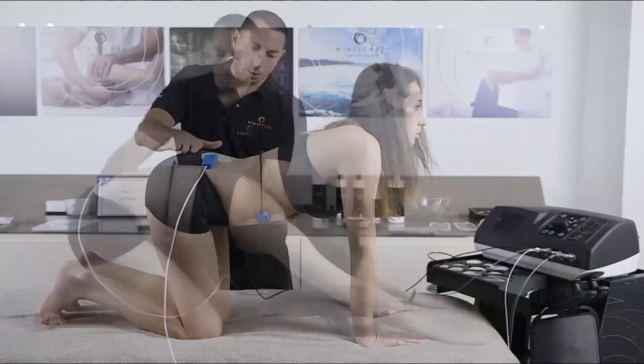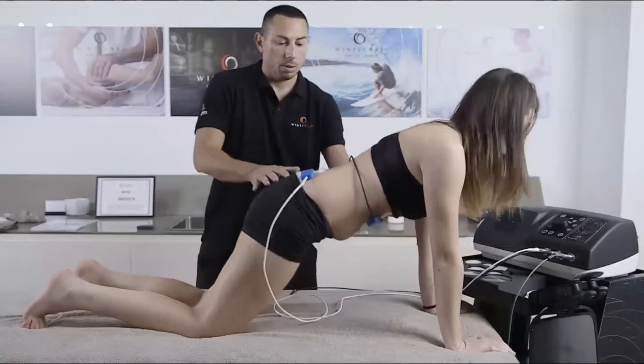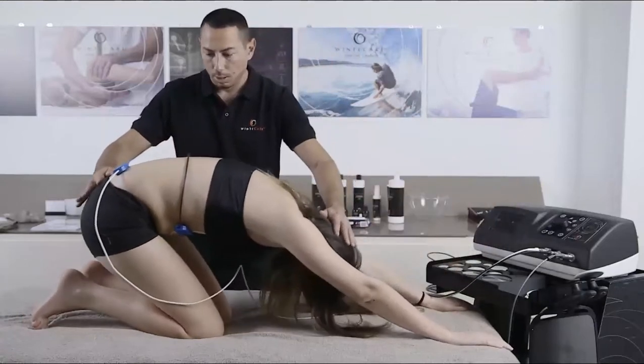tissues. That makes the treatment effective and at the same time safe for both the patient and the therapist.